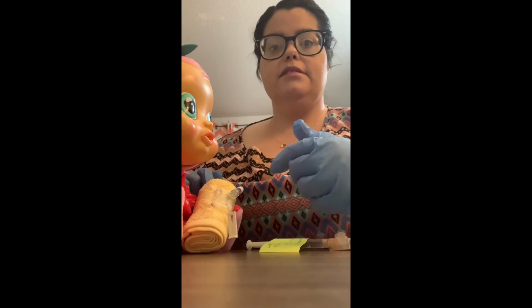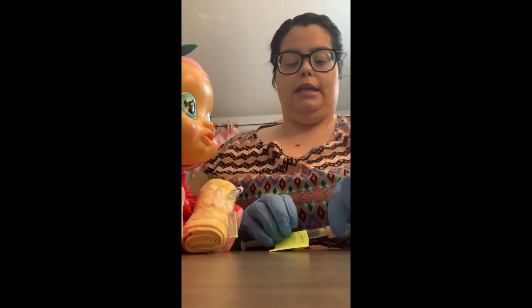So now that we have checked that our IV is patent and our site looks good, we can now proceed on administering the medication, which is bumetanide, 0.5 milligrams and 2 mLs, and we can proceed.